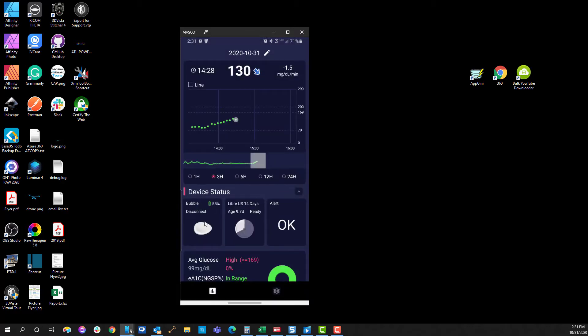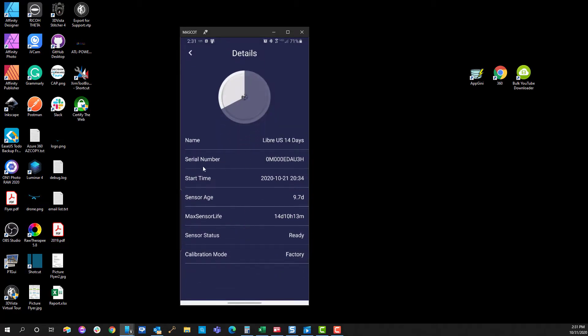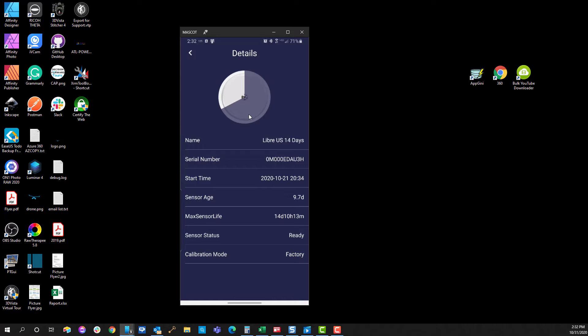Let's scan. Now that we're scanning, we should be able to find a bubble, and there it is. As soon as we click it, it says disconnected, and now it says connected. What we've done is we've now connected the bubble device. Because the bubble device is placed on top of my Libre sensor, it is able to get and read the information from the sensor. I have the serial number, the start time, the maximum sensor life, and all the information pertinent to this particular sensor. We do have the ability to calibrate the sensor. Basically what that does is it takes the Libre sensor reading and gives you an opportunity to adjust for any offset.